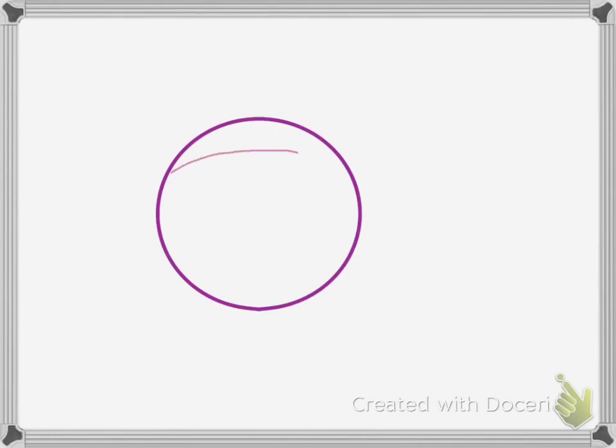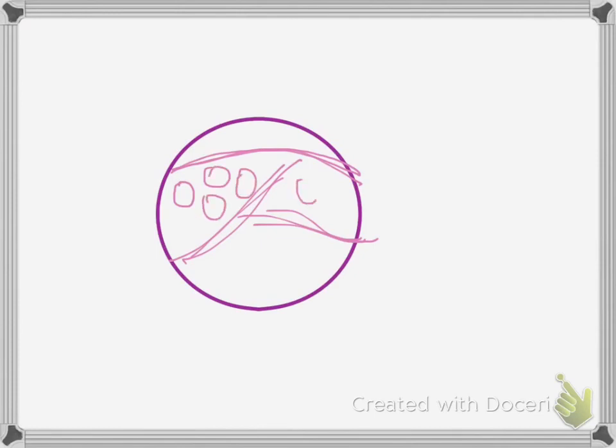Last, I will tell you how to draw. Okay, now, how to draw? We'll take this color to draw the capsule. So, first draw the capsule and you should draw the nerve fibers and then nicely unipolar neurons in groups. Here also you should draw the unipolar neurons in groups. Then take the hematoxylin and draw the centrally placed nucleus.